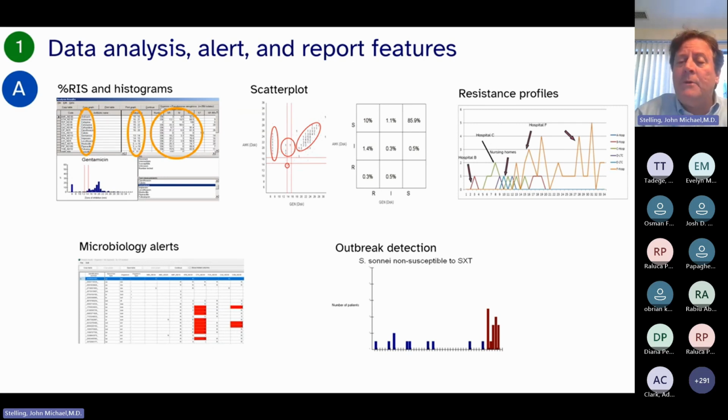These particular data are from a publication that we did with Argentina on the use of WHONET StatScan in the community setting. We also applied this in many additional papers for detecting hospital outbreaks. And a key element of what we do is we use the resistance profile as a way of helping us to improve the sensitivity and specificity of cluster detection.